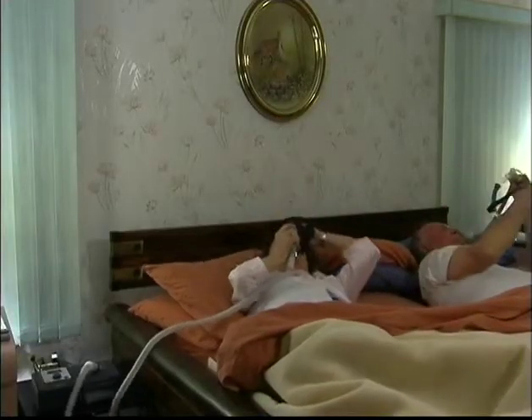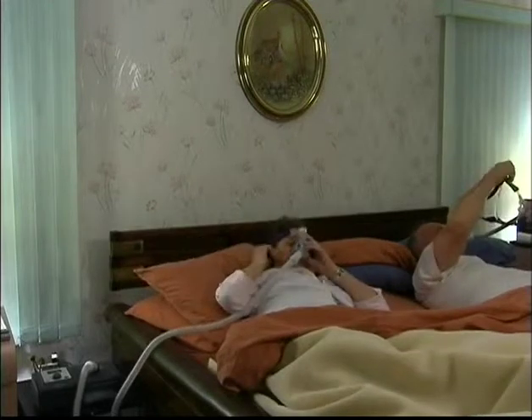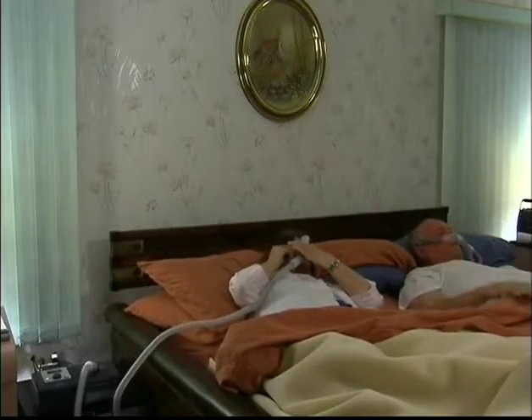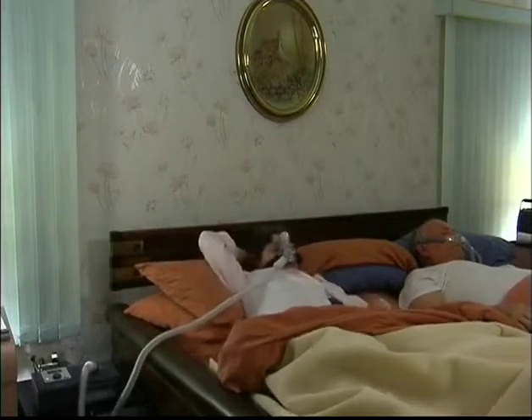You're wearing something quote unquote called a mask. It's not attractive. You're not going to like it for the first week or so. Oh, it's a pain to put it on and off, and if you have to get up in the middle of the night, you have to turn it off and take the mask off, and then when you come back to bed, you got to put the mask back on again.